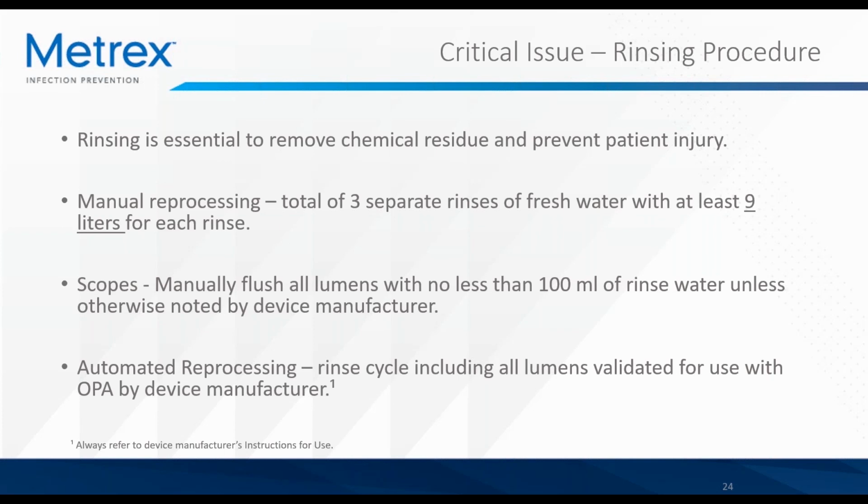There is a lot of importance placed on proper rinsing following high-level disinfection. These semi-critical devices are, as you know, making contact with mucous membrane in the body, so it's important to ensure that all chemical disinfectant residue has been thoroughly rinsed and removed from these devices to avoid patient injury.